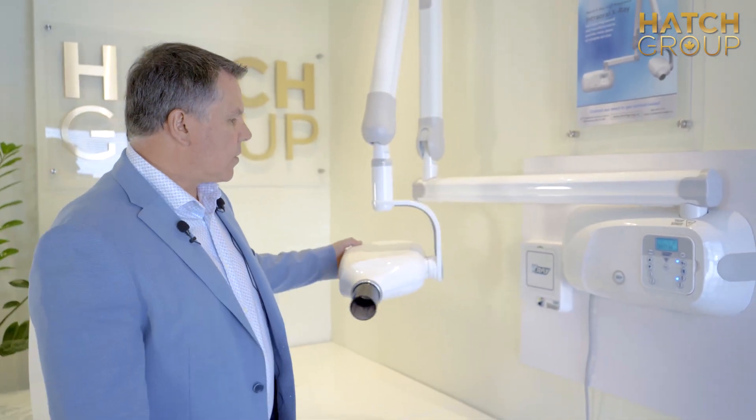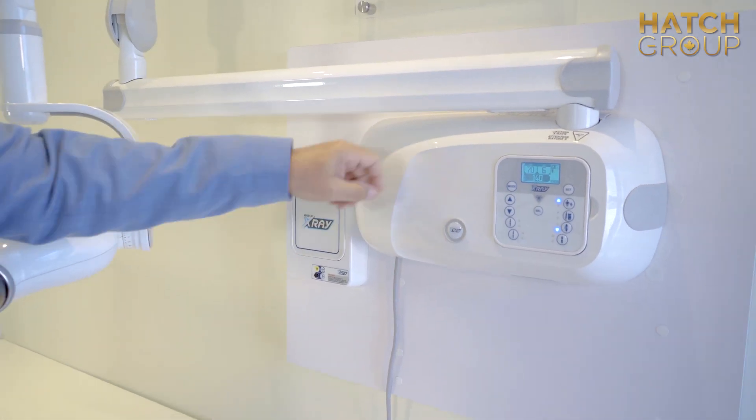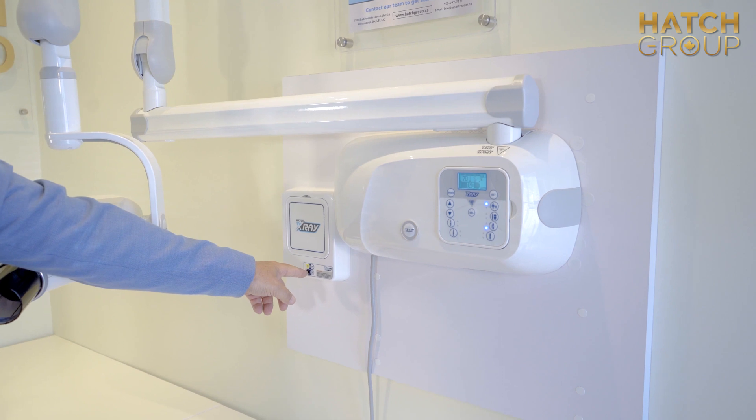Another nice feature is you've got your doorbell over on the wall on the outside of the operatory. You can have the panel in there or in the main control board, or you can have it in both. It's up to you, and here is your doorbell.